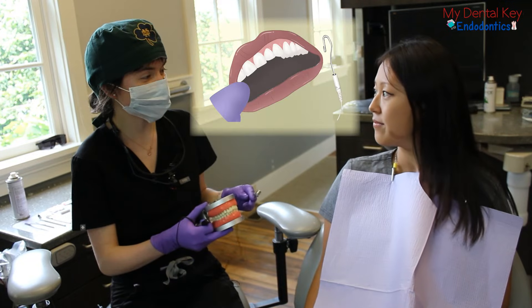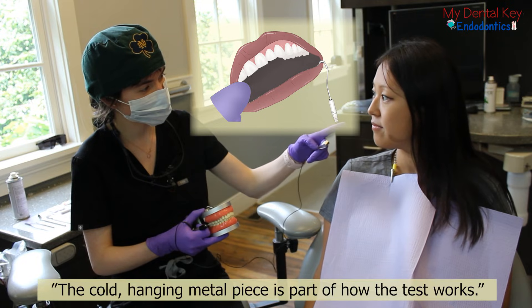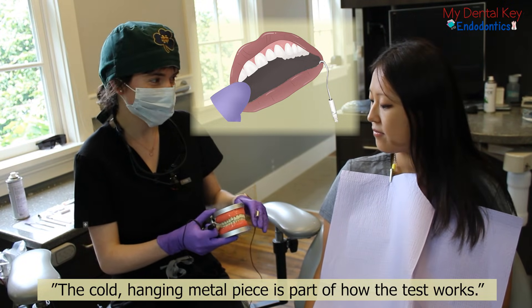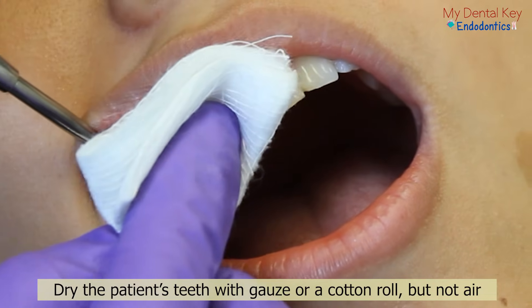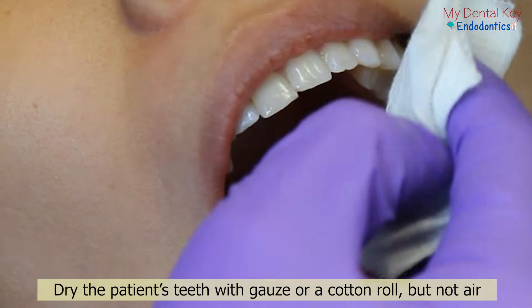If the grounding component hangs from the lip of the patient, explain this to the patient beforehand — that the cold metal piece you are hanging is part of how the test works and will not be bothersome. Dry the patient's teeth using gauze or a cotton roll. Do not spray the teeth using an air syringe, as that may cause sensitivity.